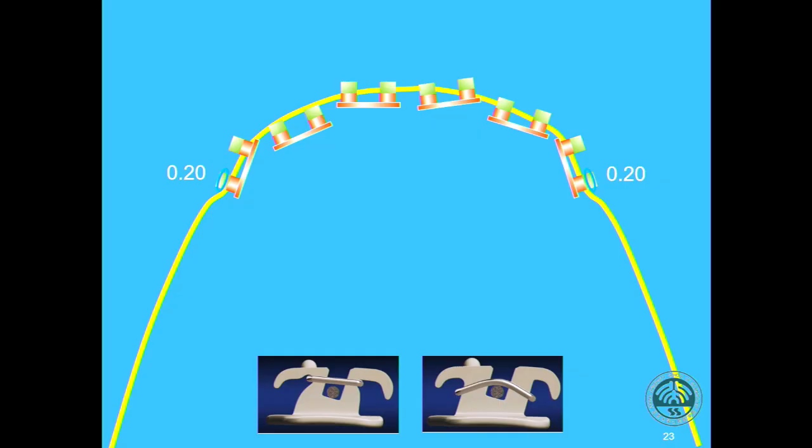We just tie the distal wing here. For larger deviation teeth, we want larger clearance, so we choose a thin ligature wire. The single wing ligating also increases the interbracket distance to reduce the stiffness of the archwire like this.